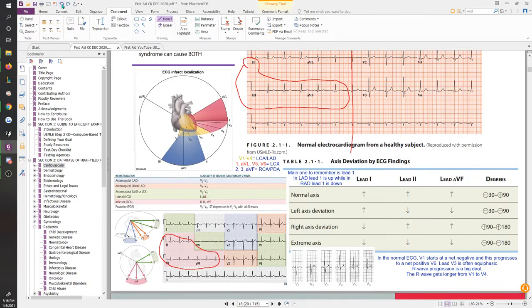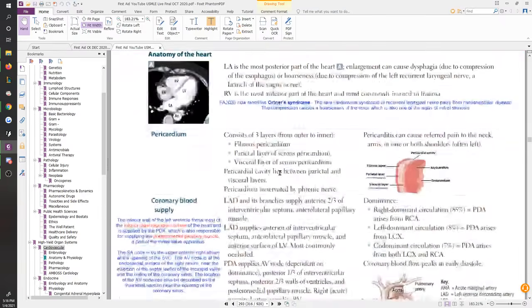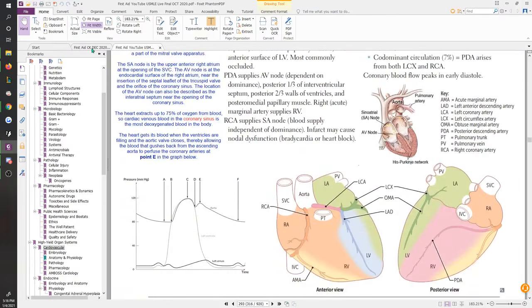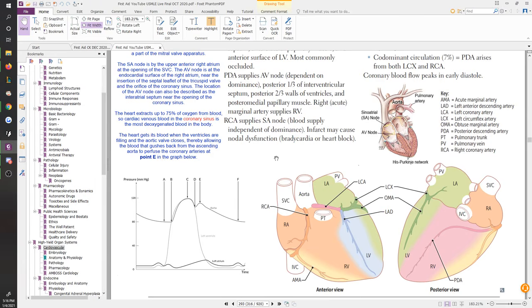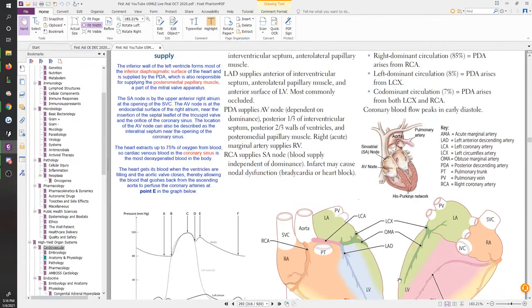So what you're seeing here is an axis of the heart. 2, 3, aVF is actually really critical, mainly because of the arteries it looks at, right? So it looks at your right coronary artery and your PDA. So if you haven't refreshed that in quite some time now, you want to make sure you go back to First Aid Step 1 and check out the cardiovascular anatomy, right? So First Aid CK, one of the flaws it has is that it's assuming you're done with Step 1, and it's also assuming that you have pretty good recall of everything you did in Step 1 studies. Right, so you want to make sure you know the arterial supply and the anatomy of the heart.